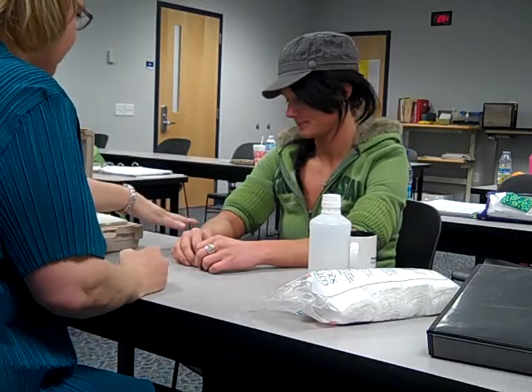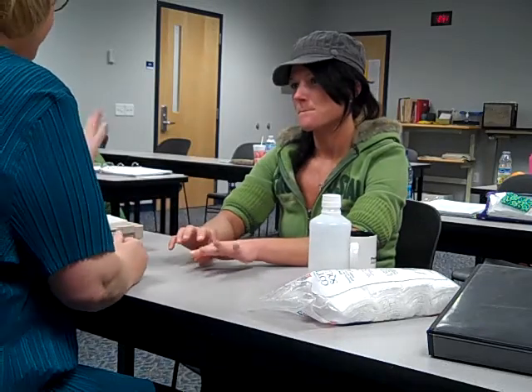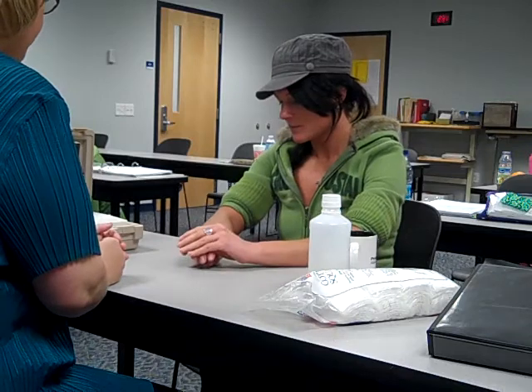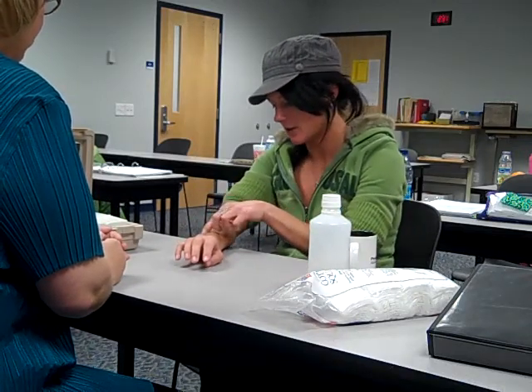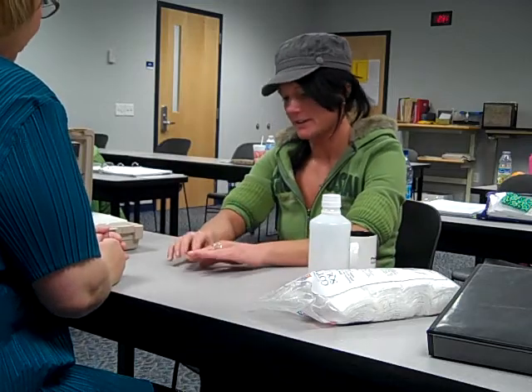I understand your pain is in your forearm here. Can you tell me a little bit about the pain — where it is, what it feels like? It feels like just sharp pains going all throughout this area, very uncomfortable.